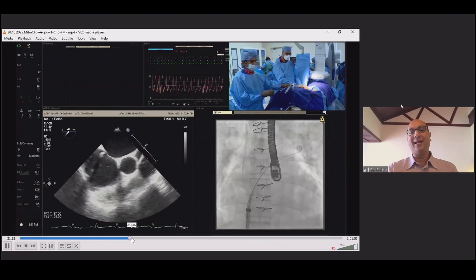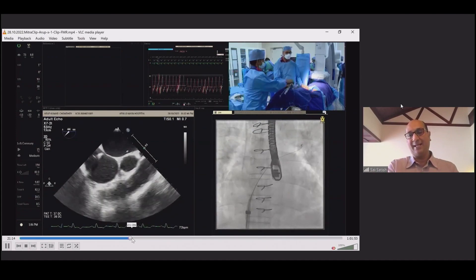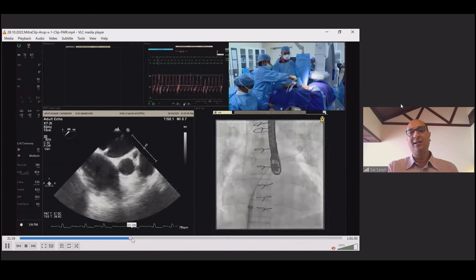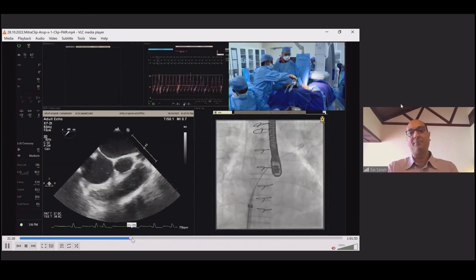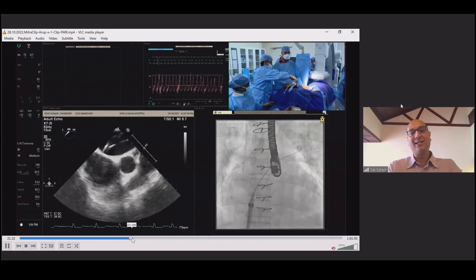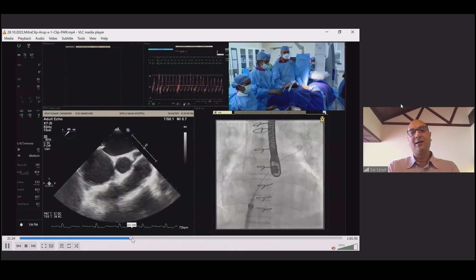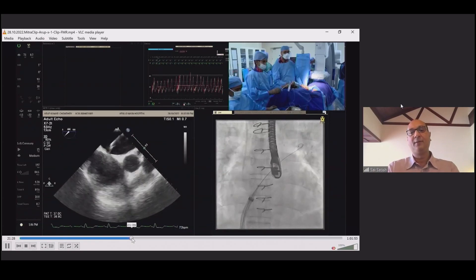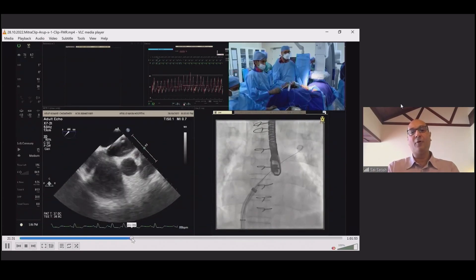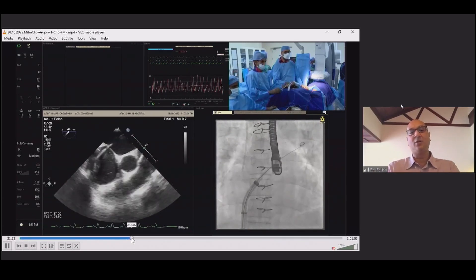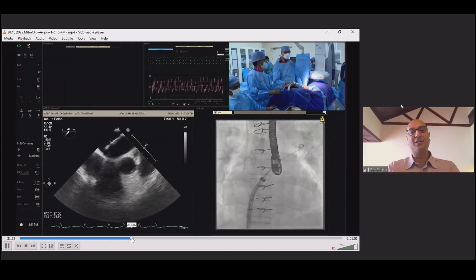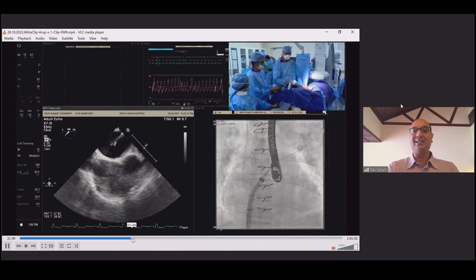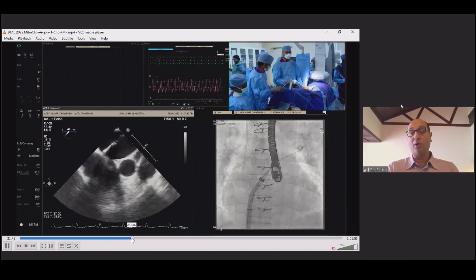By reducing this LA pressure, whether his LV improves or not, clinically he's definitely going to feel better — which is the beauty of this therapy. Pigtail is in, LA pressure is live. The second Amplatz super-stiff wire takes the steerable guide catheter. Depending on the anatomy, I like to sometimes give a little guide negative — almost horizontal — it helps me pop across the septum a little easier. You can see the nose cone is in. In real time, I wiggle it a little forward and backward — you can see the serrated nose cone in echo — and there I just pop right in.